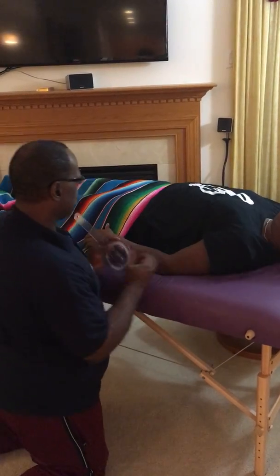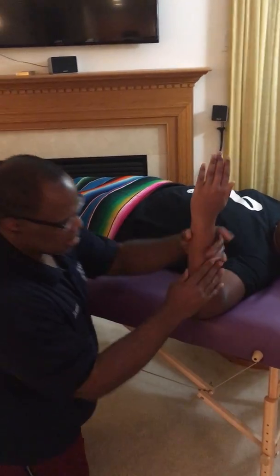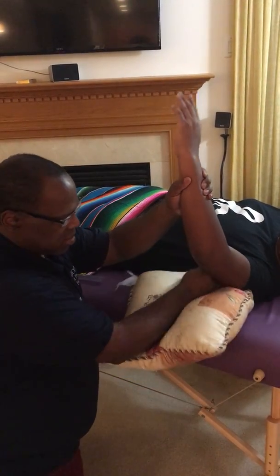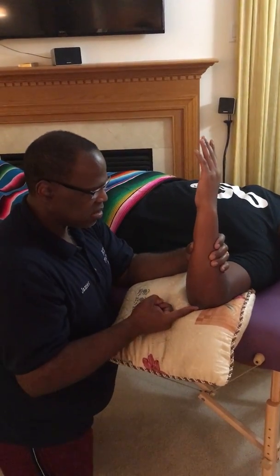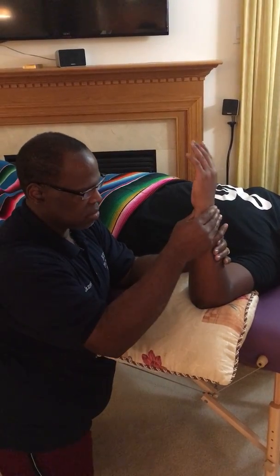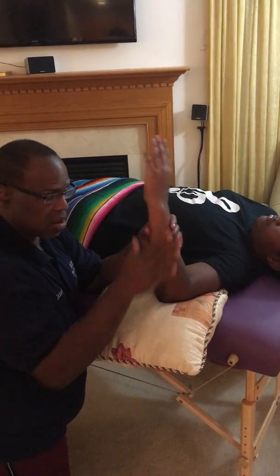All right. If we're working with internal and external rotation of the shoulder, the arm is in this position here. And we'll just take this little pillow here just to be our example of a cushion underneath. I think this is a little bit too bulky, but you get the idea. So we're placing something underneath this distal end, not necessarily this high, and this is going to be the starting position. This is internal rotation, this is external rotation. All right, you get the idea.